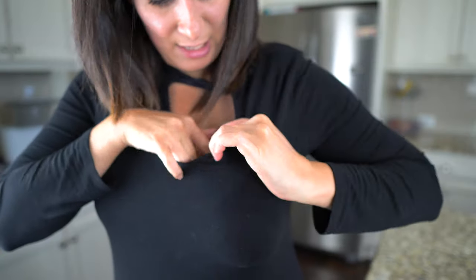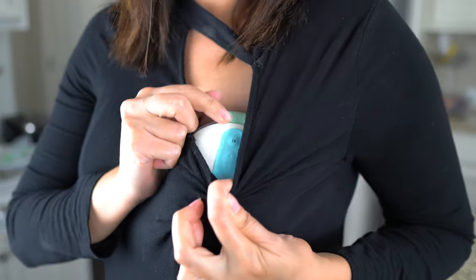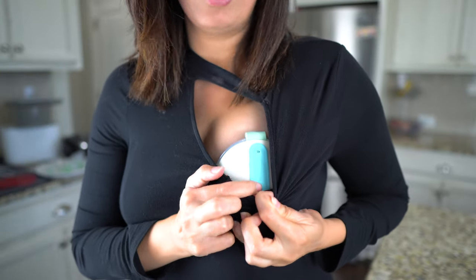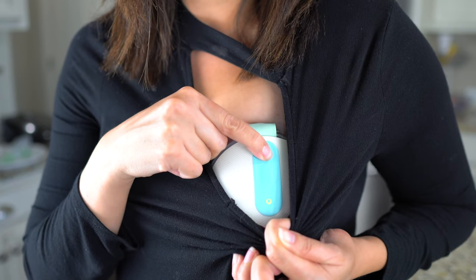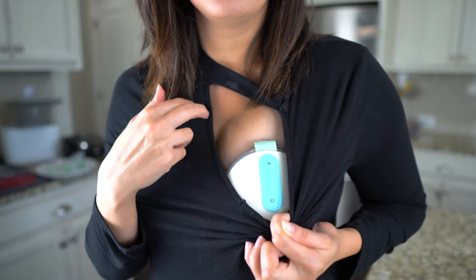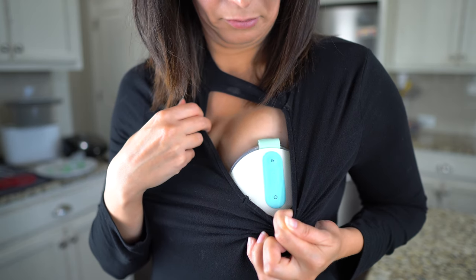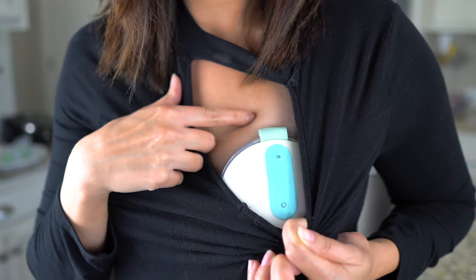When you have this in and you are properly aligned, it's going to be really simple. Just turn on the power button. The pump is on — push play and it's going to go into stimulation mode. And now it's in stimulation mode.